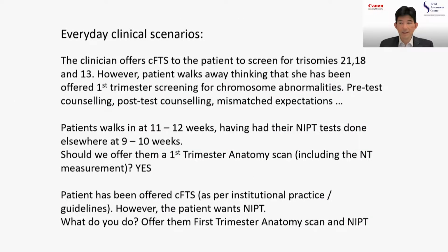But I would put it to you that the clinical scenarios which we face every day don't quite fit into that category. And these are 3 of the scenarios which I thought I'd bring up. As clinicians, we think we're offering first trimester screening to patients to screen for 21, 18, and 13. However, you would acknowledge that a lot of your patients and my patients would have walked away from that consultation thinking they've been offered first trimester screening for chromosome abnormalities in general. And hence, this raises the importance of pre-test counseling and post-test counseling, and acknowledging that there has been a lot of mismatched expectations between what we offer and what the patient thinks they're being offered.